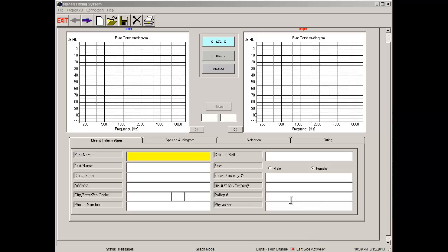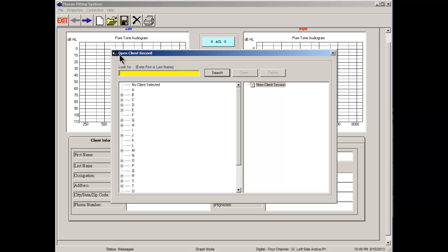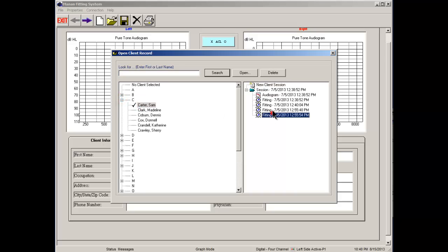To access your saved information, you're going to click this open file here. And this is your open client icon. I'm going to click on this, and this is going to bring up this alphabetized list of client data in our database. I'm going to use a client by the name of Sam Carter. So I'm going to click this plus sign next to C for his last name, Carter. I'm going to click on Sam's name, and then he's got his previous fitting data.